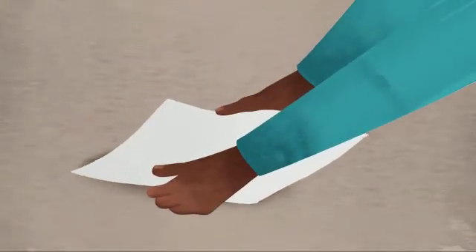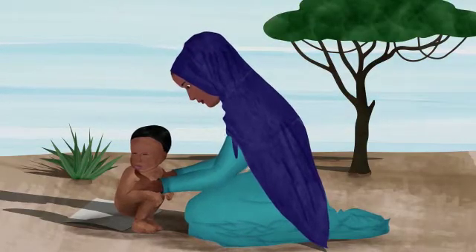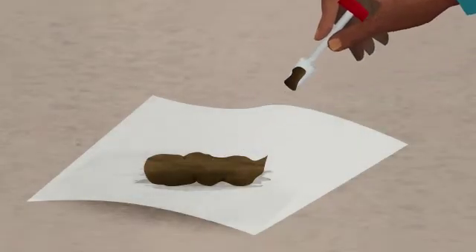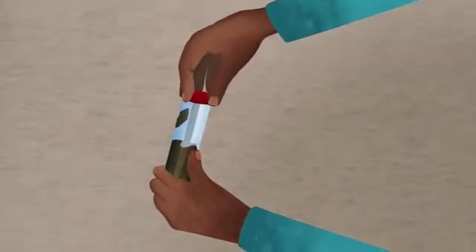Then prepare a dry area on the ground to collect the stools using the plastic sheet or a clean plastic bag. When he has passed the stool, you should collect an amount that will fill about half of the container using the spatula from inside the container provided in the kit. Put the stool in the container and screw the cap on tightly.